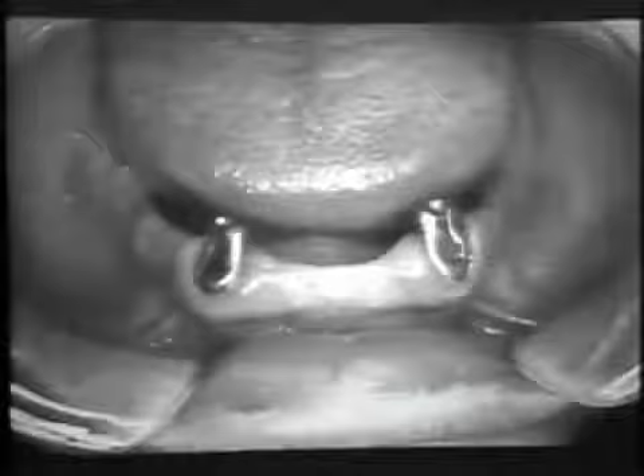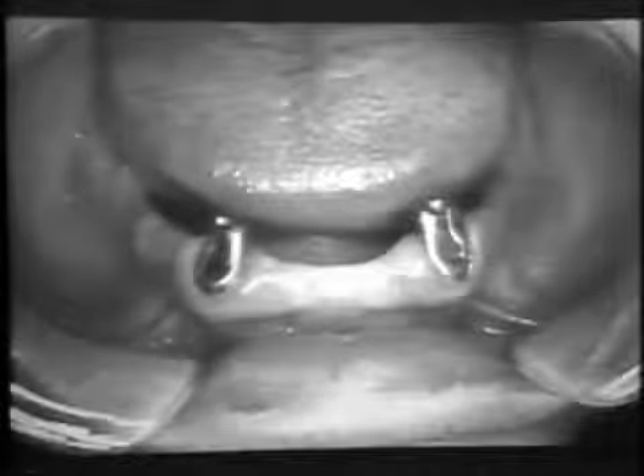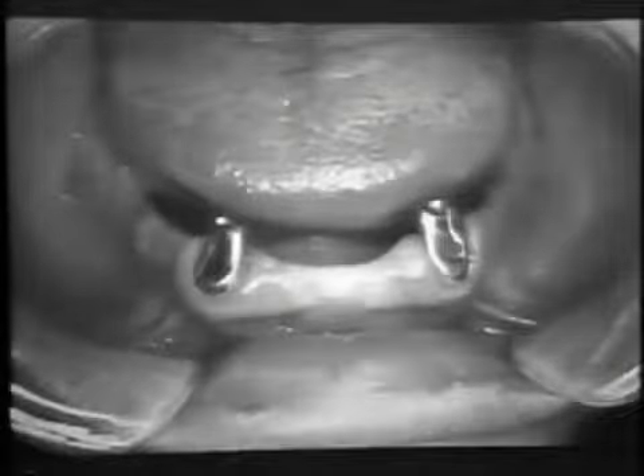The following sequence will demonstrate the fabrication of what is commonly referred to as a high coping. This particular coping is used on teeth of sound periodontal condition to enhance retentive and resistance form for the overdenture.